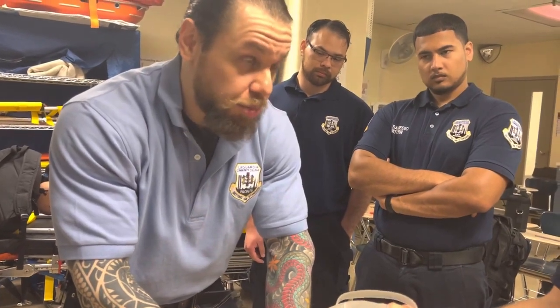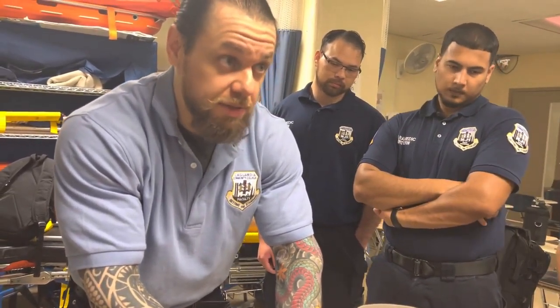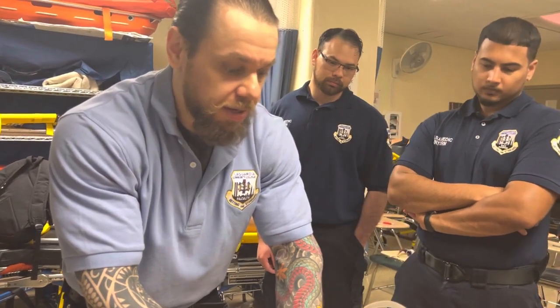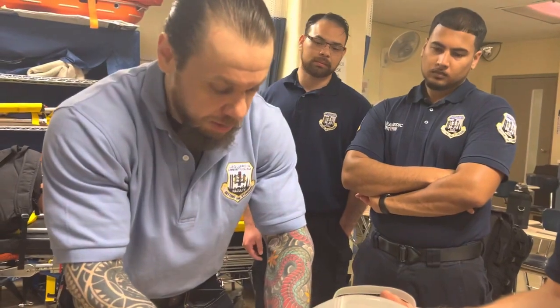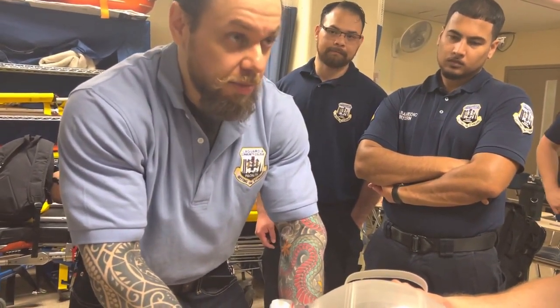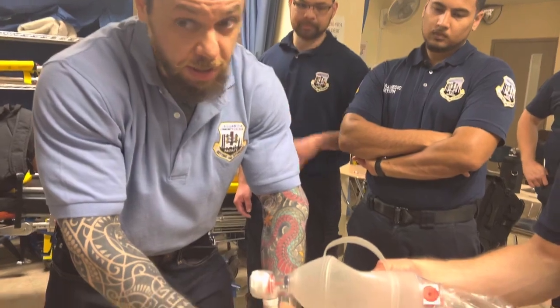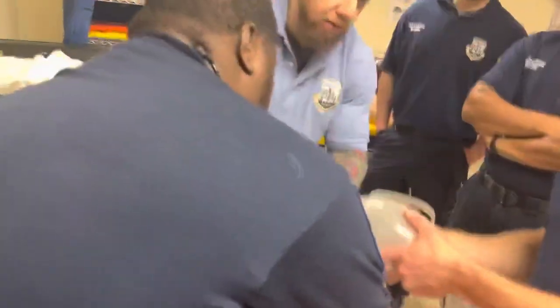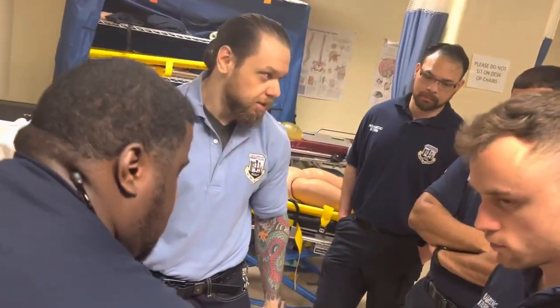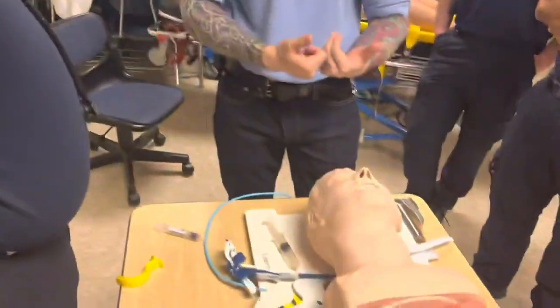I would do this to pre-oxygenate my patient before I intubate if I needed to, to get the setup ready, and I have the time frame to do it. Do I need someone doing the earmuff right now? No, I'm here, I'm stabilizing, I'm engaging, but the moment we pre-oxygenate and everything is set up, then I'll say, okay, James, come over here, grab the ears, and then we go forward with our procedure. So actually start the procedure this way so that you have practice with that. Start with pre-oxygenation first, and then we're going to do the earmuff, intubate, secure, verify. Gotcha. Okay. All right?